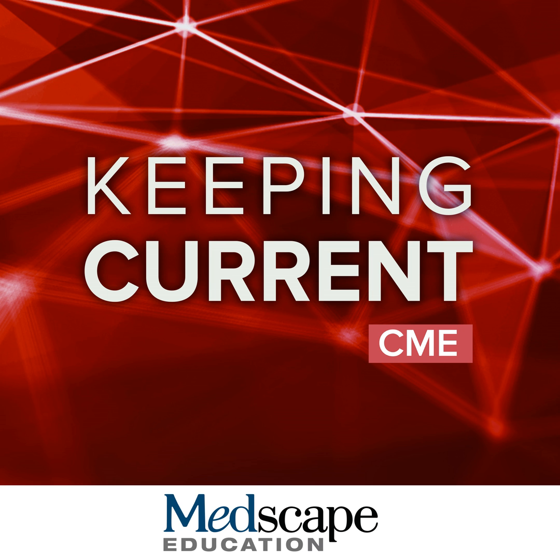And that's important to point out because that means that that patient has a low chance of recovery of the myocardium post-revascularization. This is all based on a study by Kim et al. from the early 2000s, where they showed that if patients had over 50% of the wall thickness involved, there was a low likelihood of recovery, whereas if it was less than 50% of the wall thickness involved, there was a greater chance of recovery. So this 50% number is really the kind of golden cutoff number.